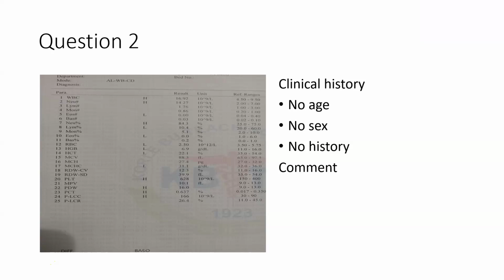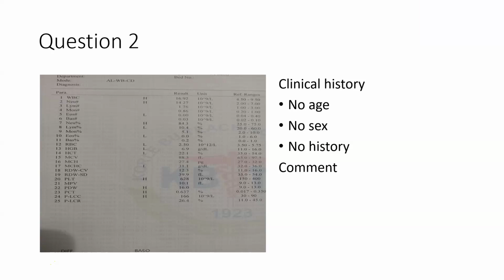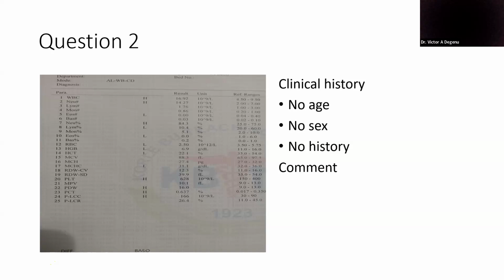And then the clinical history, you don't know the clinical history. You can comment on the film blindly when you prepare your smear, and do everything blindly until you get all the information back. Then you can conclude on your film.